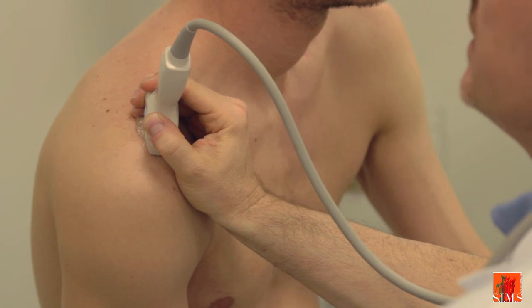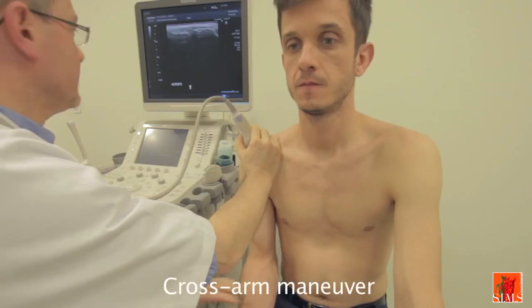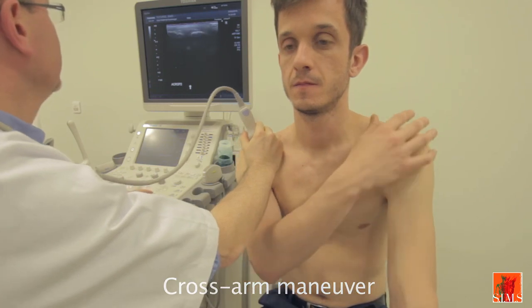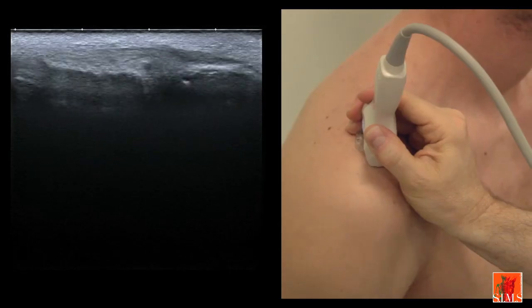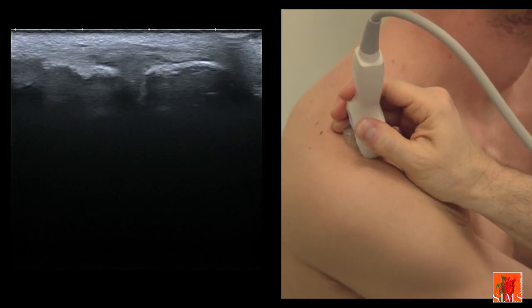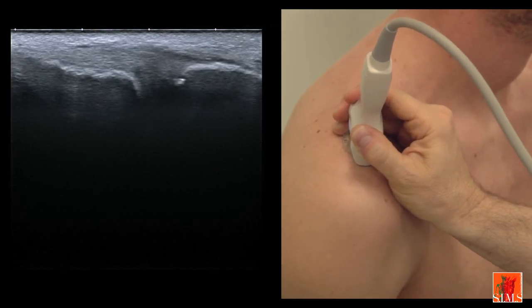We will continue with a dynamic maneuver known as the cross-arm maneuver, which consists in positioning the patient's hand on the opposite shoulder and simultaneously checking the movements of the acromioclavicular joint. The right diastasis must remain small. The amplitude of the movements must be small in normal cases.